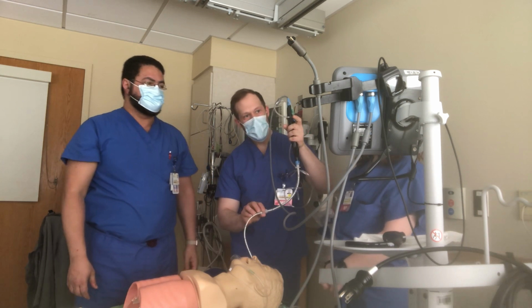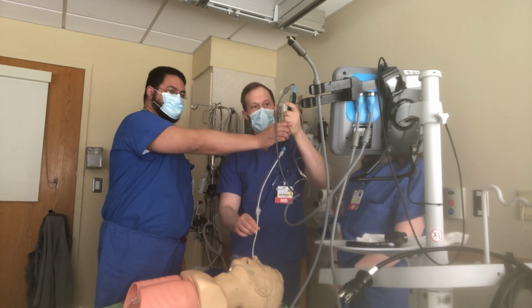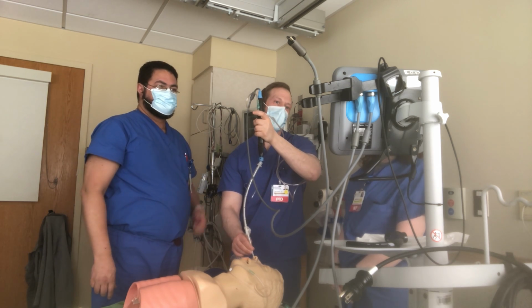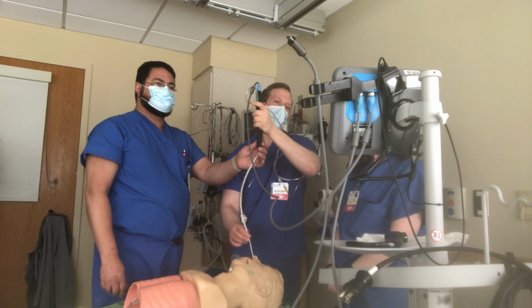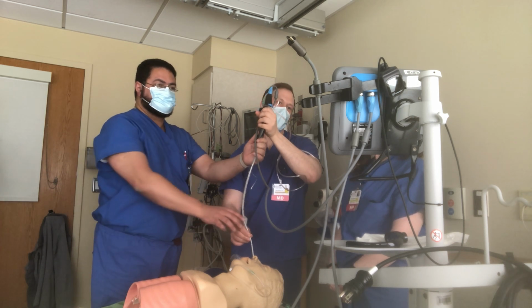All right, let's see if he can do it without doing one before. Keep the thought, right? Keep going. So let's say you're here. Go back. Go back. So that's the esophagus, and that's the larynx right there. Turn it. Right. Bring it to the middle of the screen.